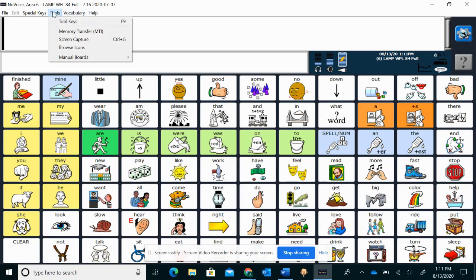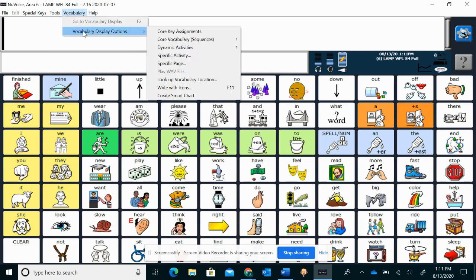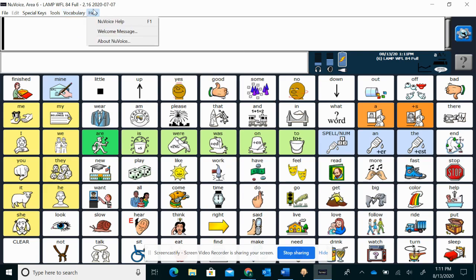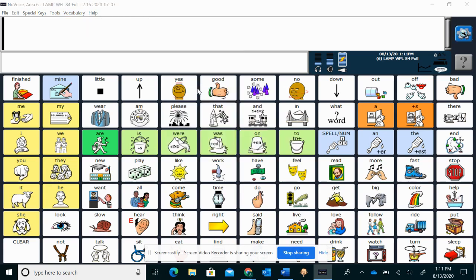So we're going to go under Tools. Or is it Vocabulary? Yep. So it's vocabulary. Vocabulary Display Options. Write with icons.